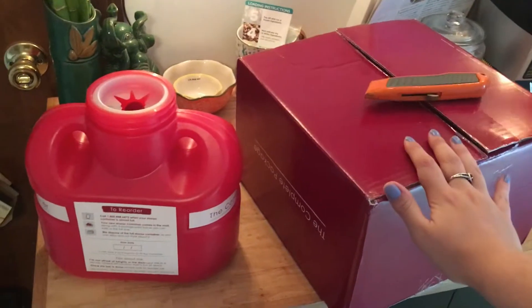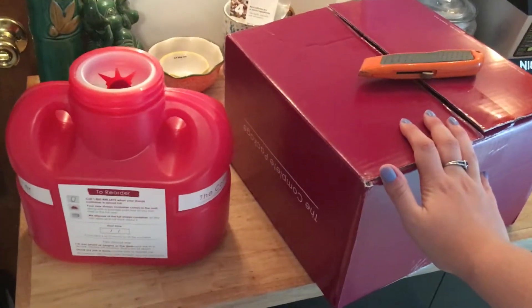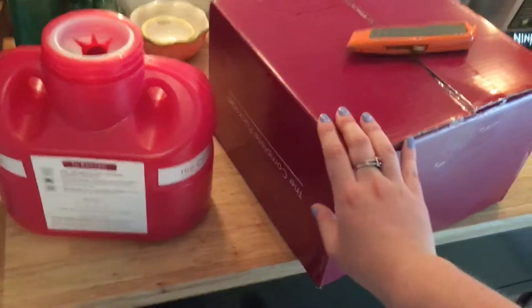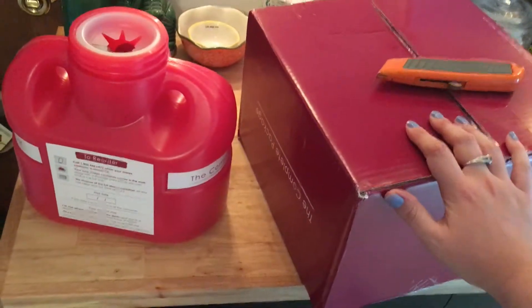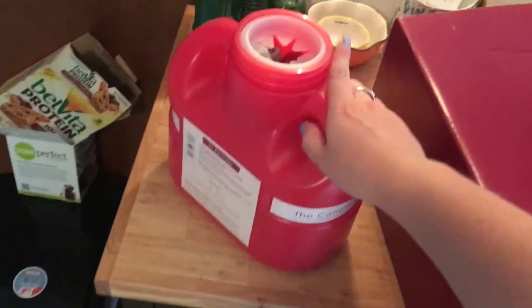I just got my Humira sharps replacement box in the mail, so I'm just gonna walk you guys through how you do this. It's really simple. If you're new to Humira, this is something free that's offered by the company — they will actually send you the kit so that you can remove all of your Humira sharps from your home.